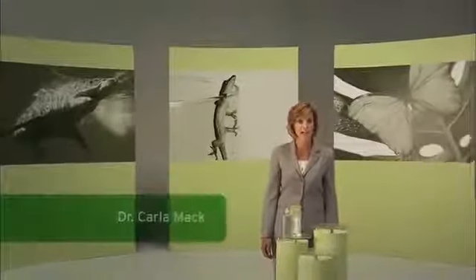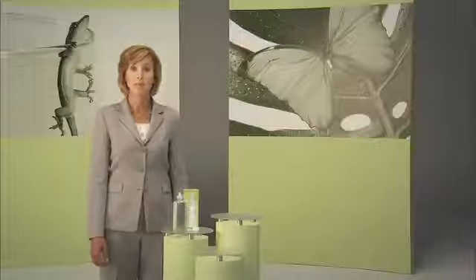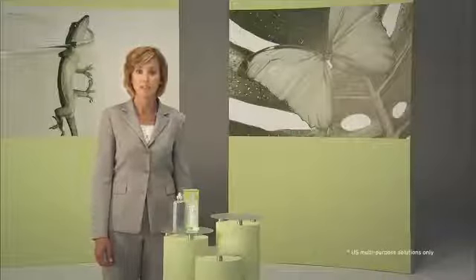Hi, I'm Dr. Carla Mack, and this is BioTrue Multipurpose Solution, an innovative multipurpose solution inspired by the biology of your eyes. I'm here to show you how you can use it to care for your contact lenses. So what makes BioTrue Multipurpose Solution unique? It's the only multipurpose solution to bring together three bio-inspired innovations.